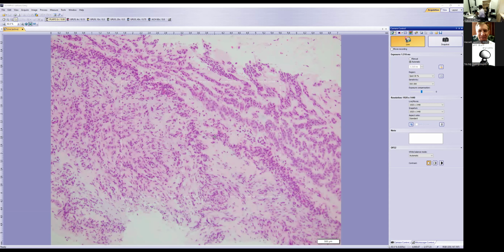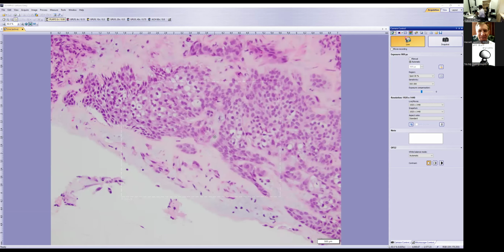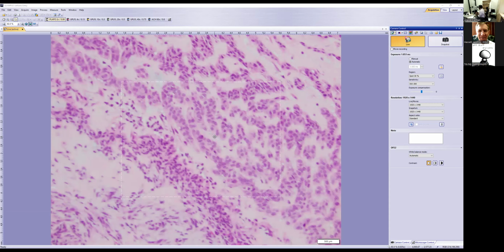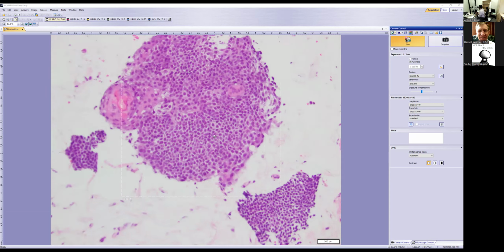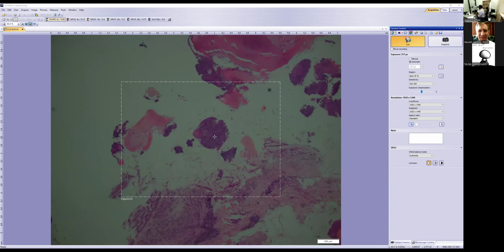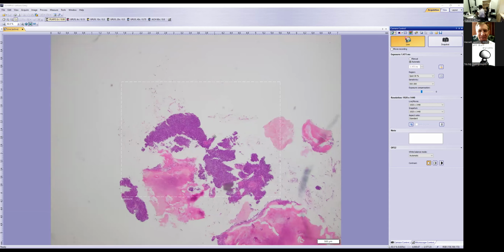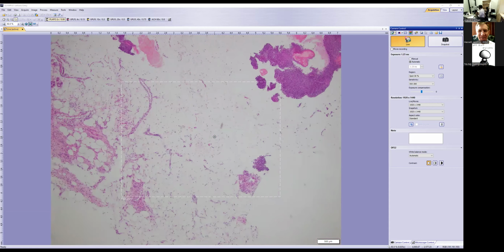But when you look at the cytology, they look relatively okay. They were bland looking. There's some degree of atypia, not significant. And if you look at these cells which are associated with the keratin, they look again more basaloid. So I called the radiologist and asked them, where is this located? Is there any skin lesion associated with it? And there was no clear answer. They said, no, it was just a mass in the axillary tail.